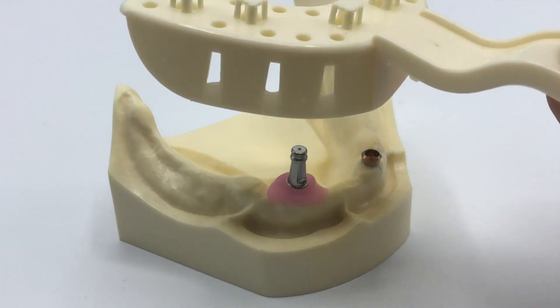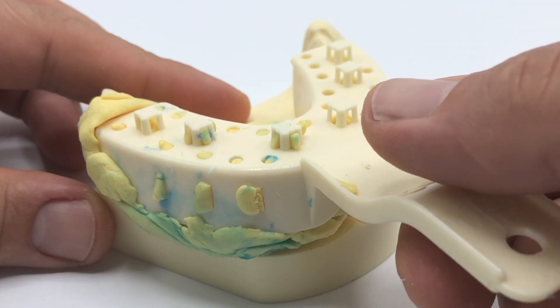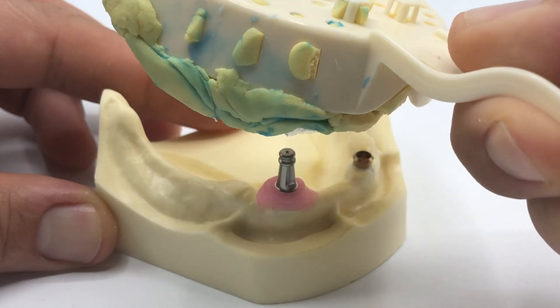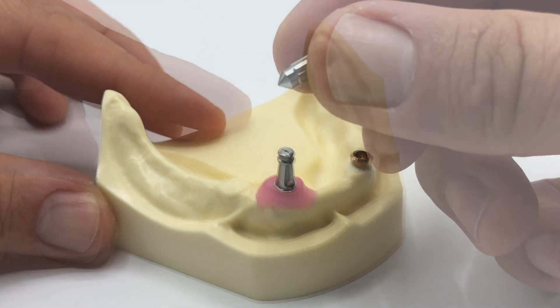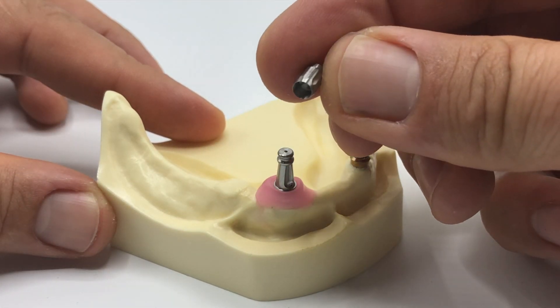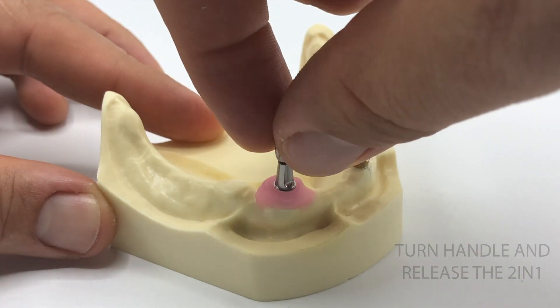Next step is a standard closed tray impression procedure. Remember, the higher the quality of your impression material, the more precise the impression is going to be. First, check the size of your impression tray. After taking a standard impression, take the impression tray out of the patient's mouth. Remove the 2-in-1 impression abutment out of the patient's mouth — turn the handle around and use it simply as a removal tool.